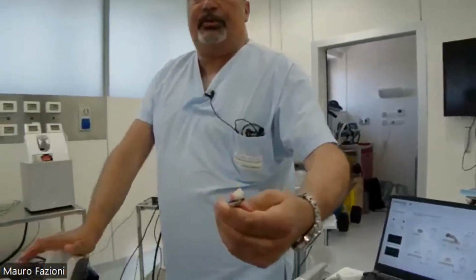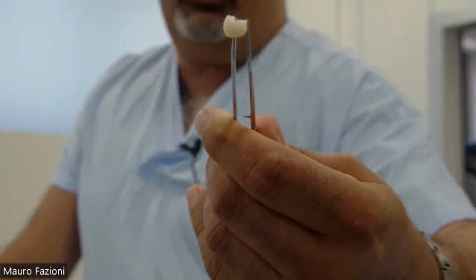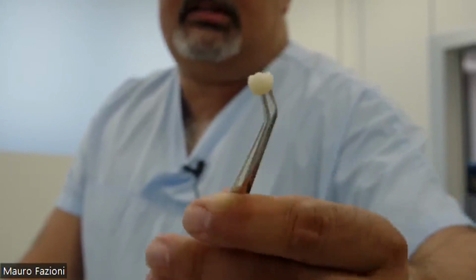This is the tooth ready. You can see the photo shade approach in 3D. We can share with you photos if you want. And now we are ready to glue into the abutment and screw it into the patient's mouth.